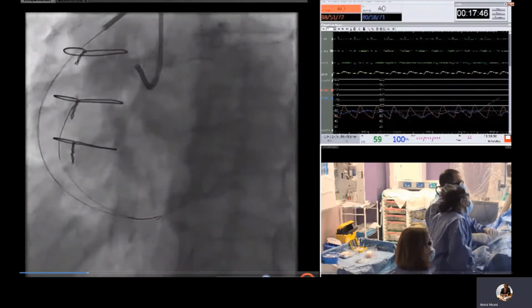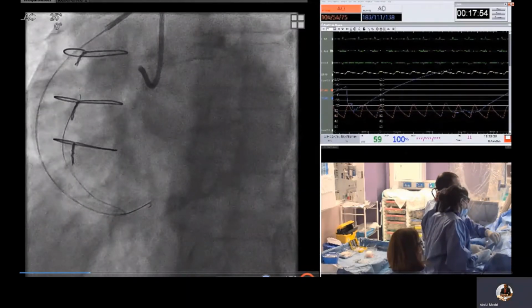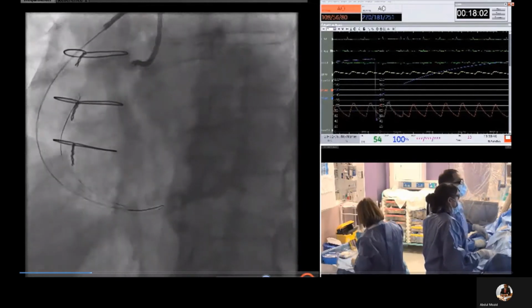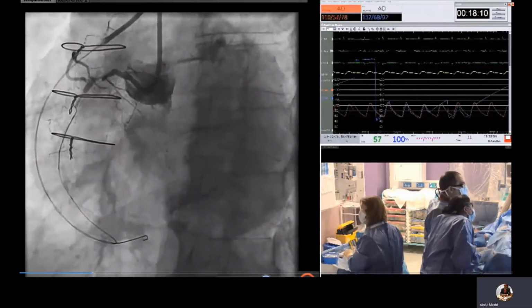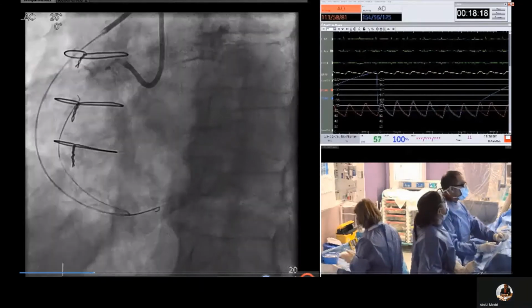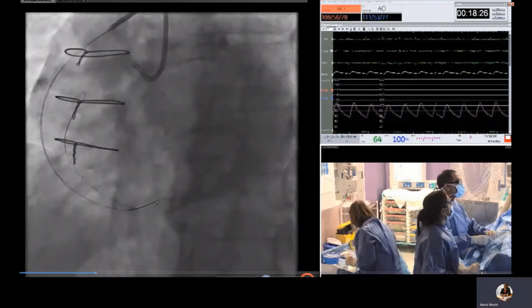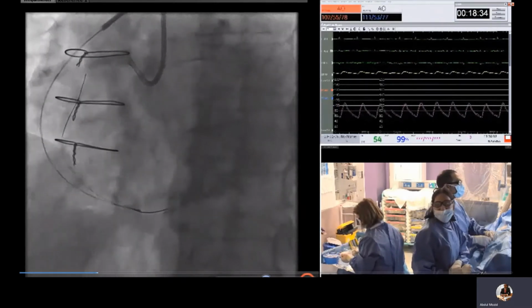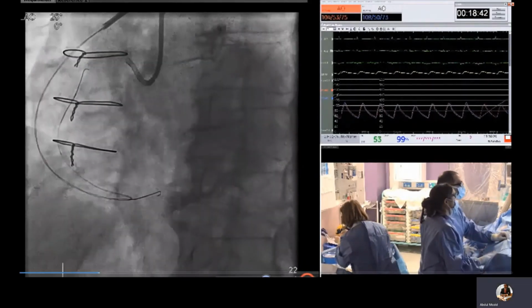So here we then come to the true occlusion point, taking an antegrade picture. With antegrade picture, we can see that we are very close at this point to crossing. However, it is not possible to redirect the Pilot 200, which is clearly in a subintimal plane. And here we are again wrapping around the vessel, and this is clearly subintimal. Confirmed antegrade injection.